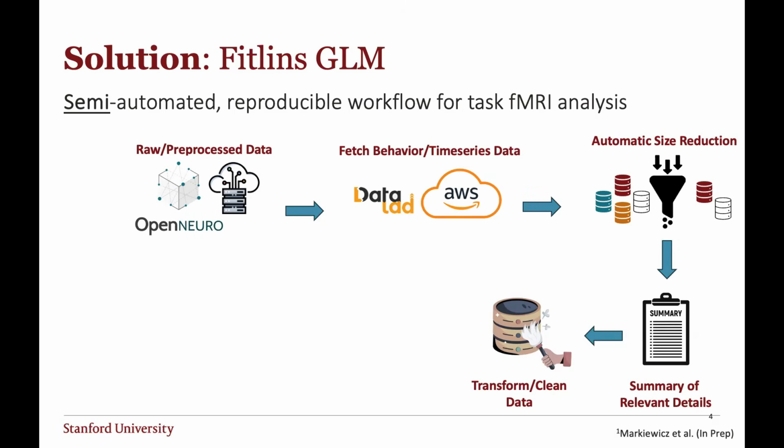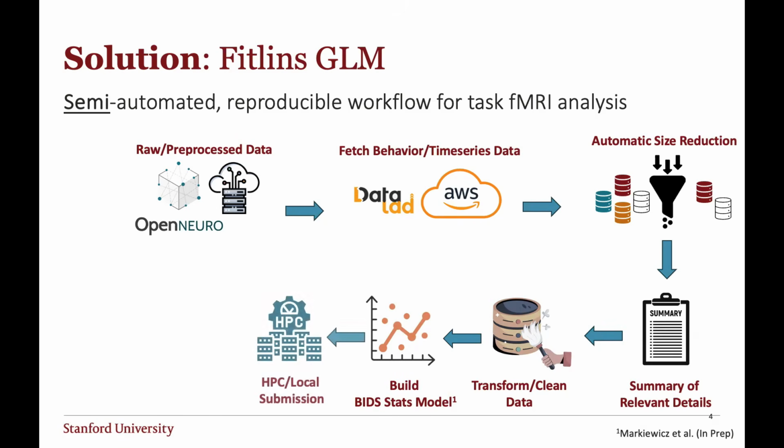So it's this consistent application to each event file for each subject, run, etc. And then once your data is ready, say your BOLD files are trimmed, if there are calibration lines that need to be removed, and your event files are prepared, you have the regressors and the onsets and durations aligned with the conditional values you're interested in for your model, you build your model. And this is where we have the BIDS Stats Model, which is kind of the Fitlins wrapper that we focus on.